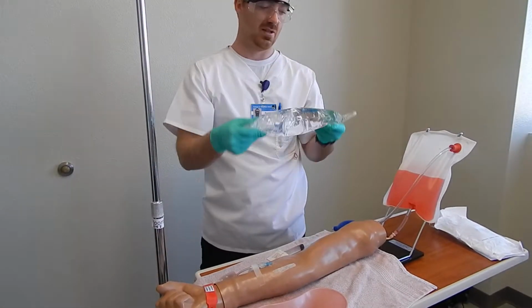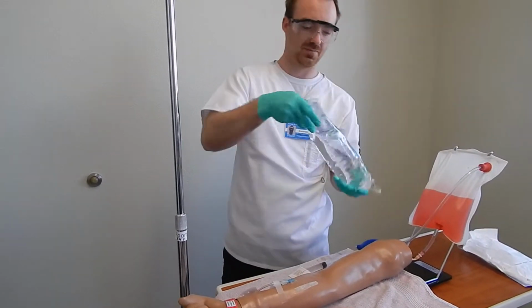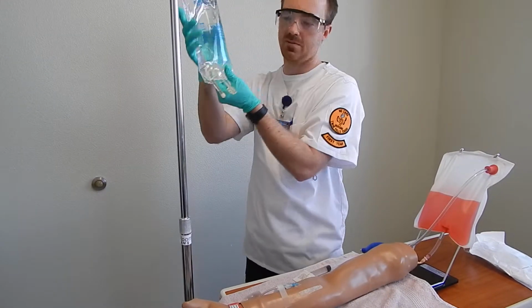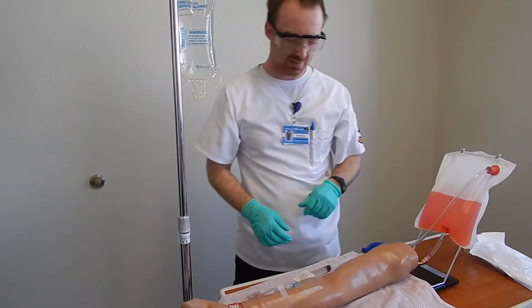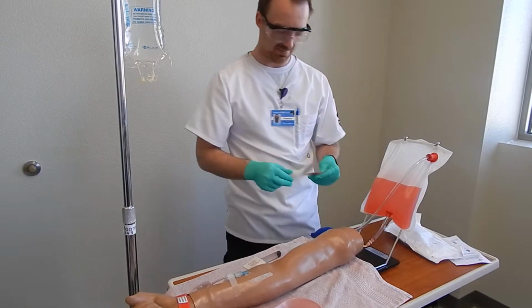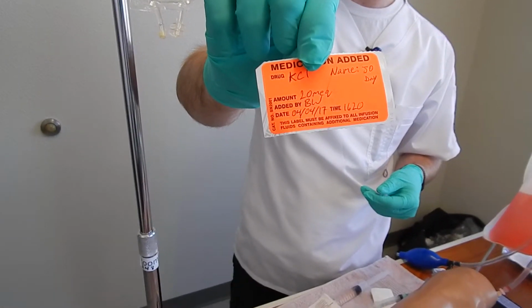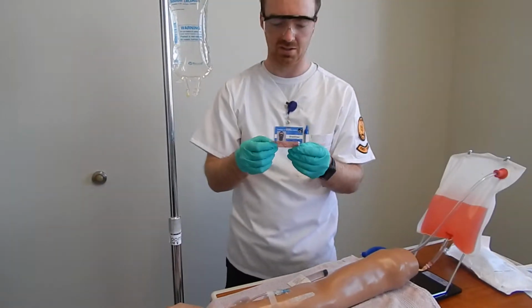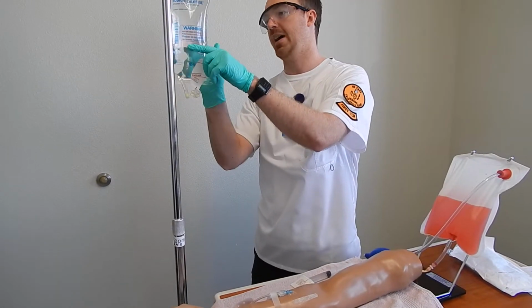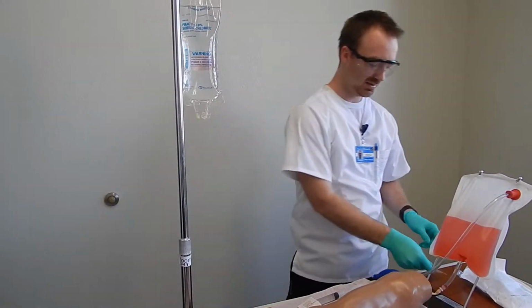Next I have to make sure that my medication gets well mixed together. Hang it up there. Next, I attach this label that is filled out: patient name, date, who I am, what medication I put there, what time I did that at. And we'll slap that on the back so that you can still see the original and still calculate how much has drained into the patient.